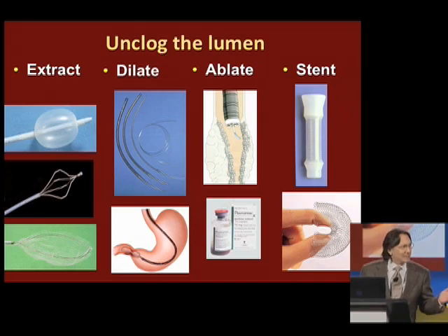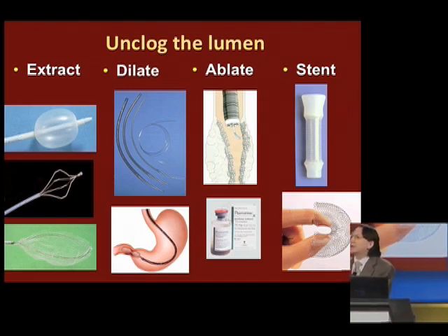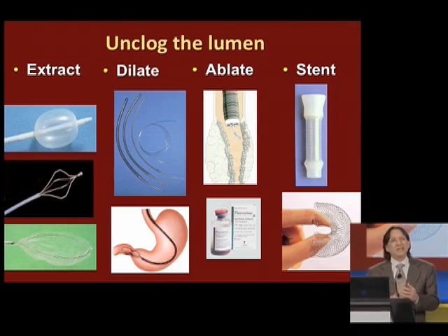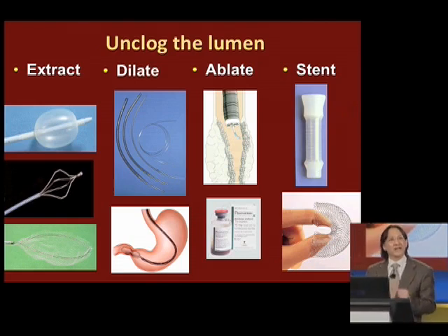We can dilate using bougies or non-compliant balloons. We can ablate using thermal modalities. We once used very high-tech things like laser. Now it's been supplanted by more user-friendly modalities like argon plasma coagulation. And then we have very clever ways of combining drugs and devices to perform, for example, photodynamic therapy, where we can minimize the collateral damage.